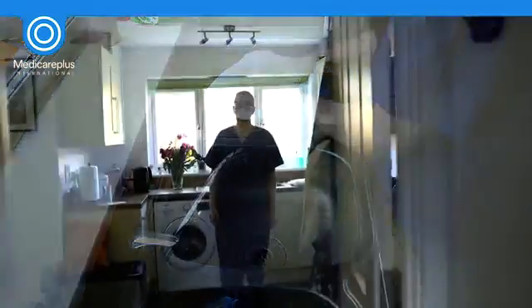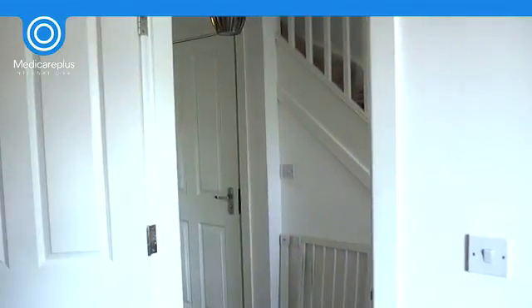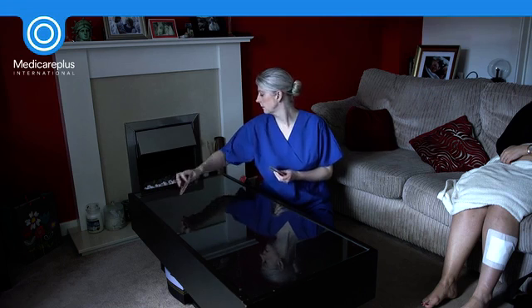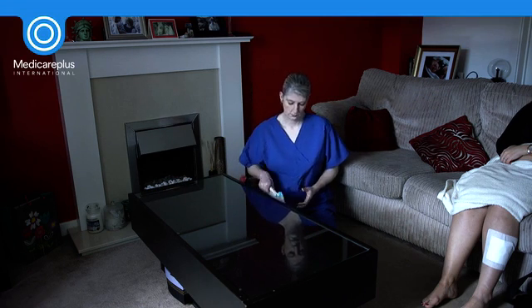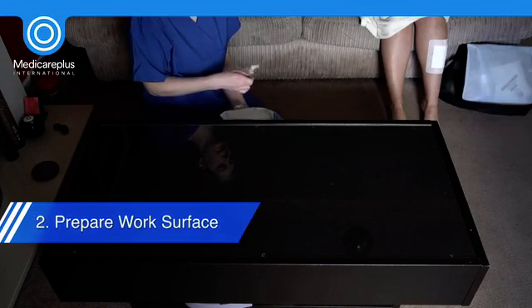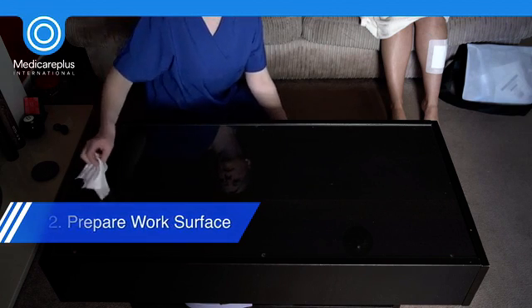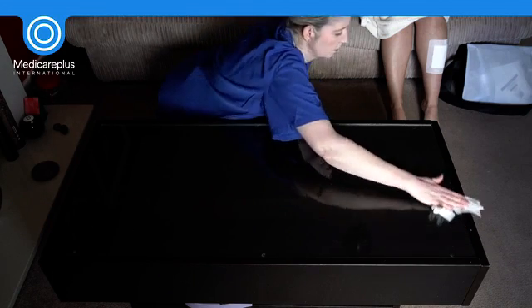A suitable working surface from which to prepare your equipment should now be identified. This can be one of the more challenging aspects of performing a wound dressing change in a non-clinical setting. A table or bedside drawer free of clutter would be a suitable choice. Avoid placing equipment on the floor if at all possible due to the high risk of contamination. If there is no other available surface, a clean apron can be placed onto the floor so the dressing pack is not in direct contact.